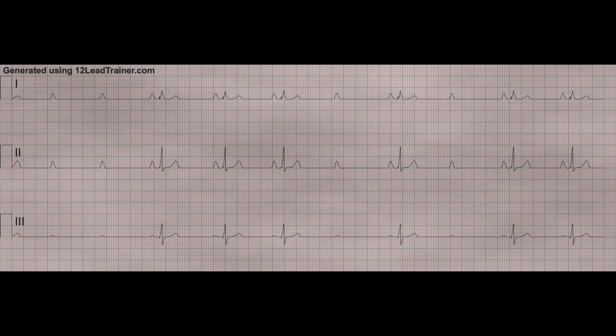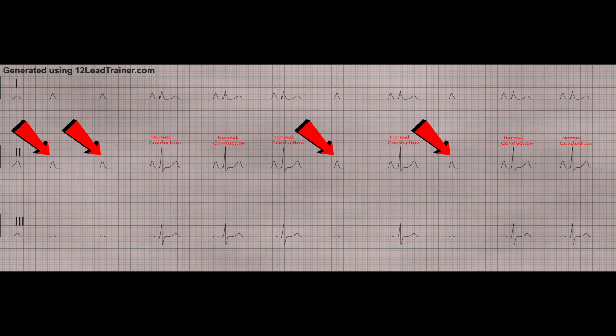Let's go over some of the features of the Mobitz 2 on the 12-lead. I've put arrows pointing to the P waves that are not followed by a QRS complex — those are the specific P waves where the impulses are blocked. If they weren't blocked, the ventricles would produce a QRS complex. Where I marked 'normal conduction,' there is a P wave, a QRS complex, and a T wave — it happens three times in a row. Then you have that lone P wave off by itself. The P wave to P wave intervals pretty much march out on a Mobitz type 2, but your QRS to QRS does not march out.